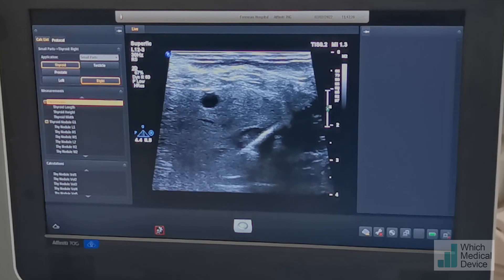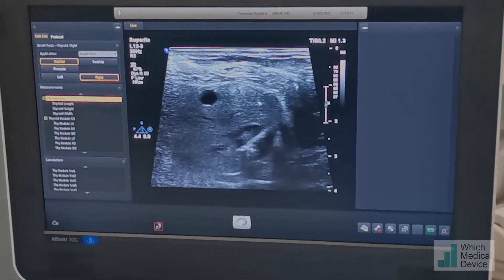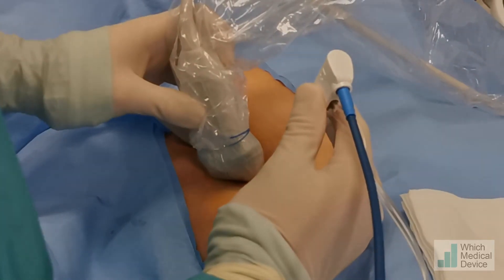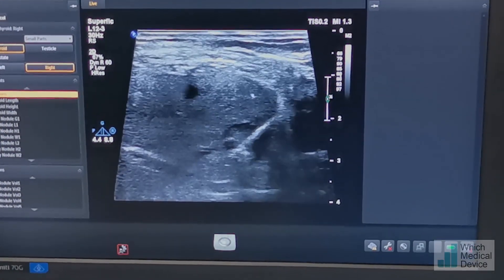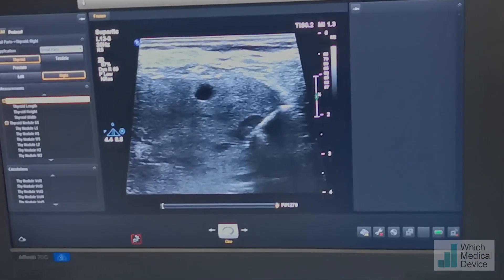There, you can see a little bit of high reflectivity — that's gas formation. Do you feel any discomfort? That's 1 minute 20 seconds we're going for, and we're going to stop there.